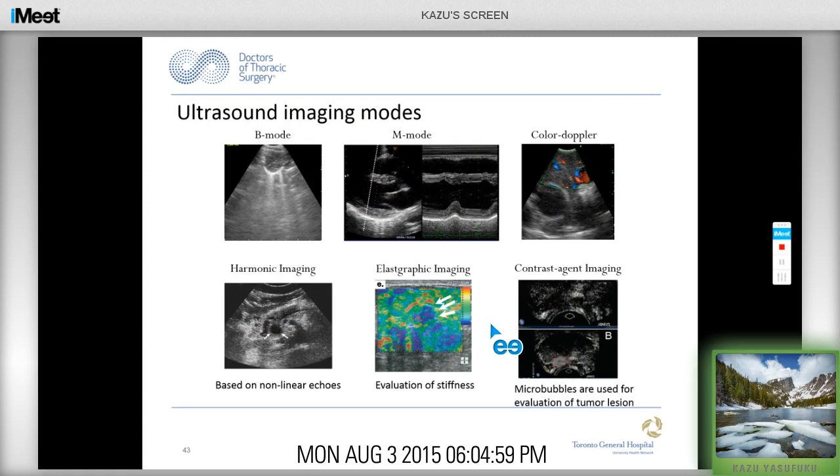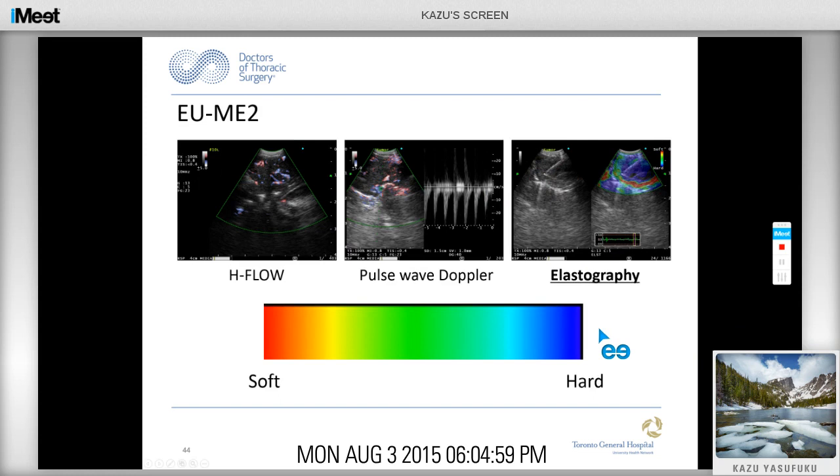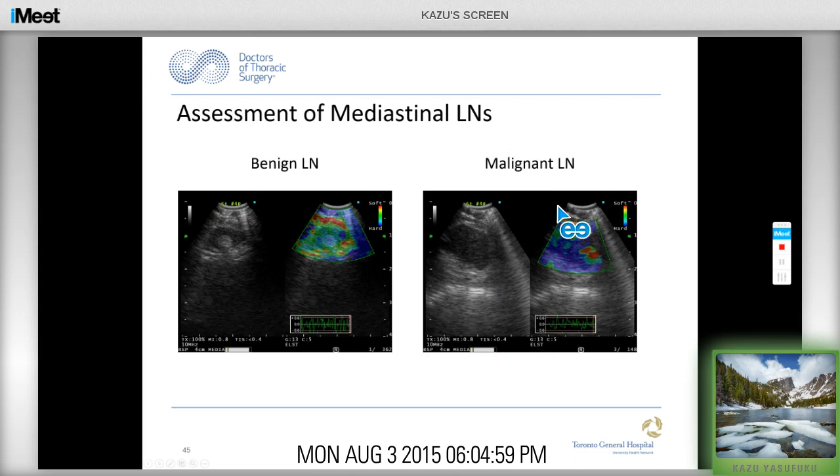There are different ultrasound imaging modes used in other fields. We all know B mode, M mode, and color Doppler, but there's also harmonic imaging, elastographic imaging, and contrast agents. These newer imaging modes will become available for EBUS. The EU-ME2 has new modalities including pulse wave Doppler, H-flow, and elastography. Elastography looks at how hard the tissue is — assuming harder tissue is metastatic, you may be able to differentiate normal from metastatic lymph nodes. A benign lymph node appears more green in color versus malignant lymph nodes showing a more bluish color.